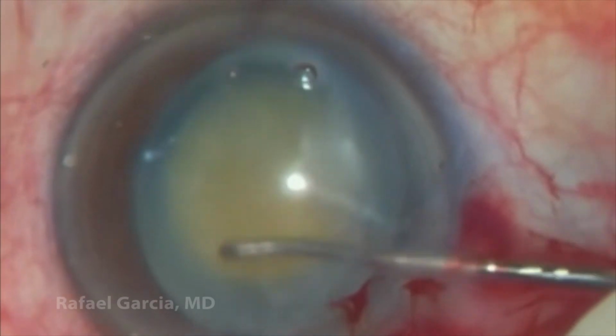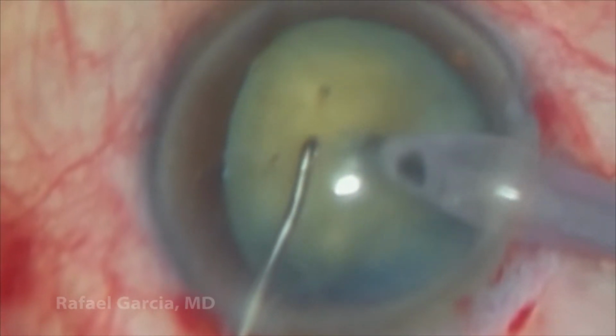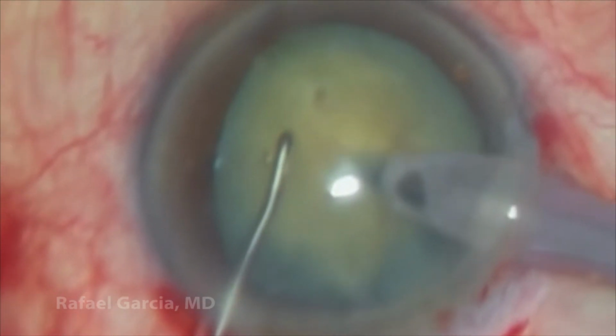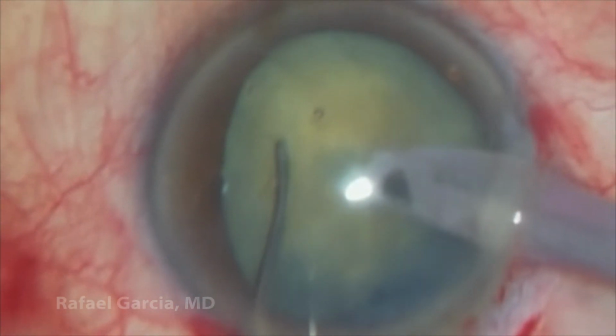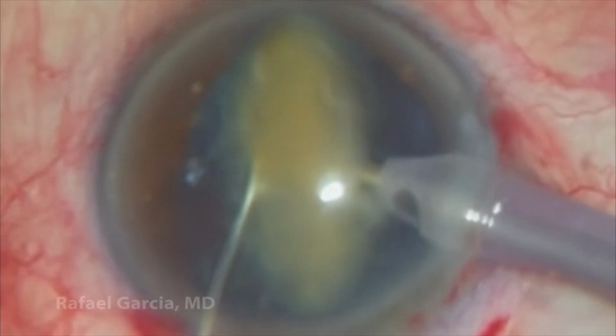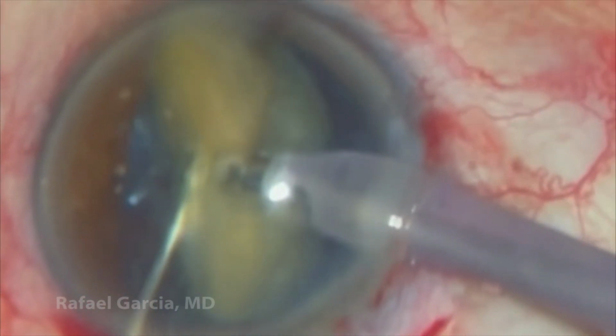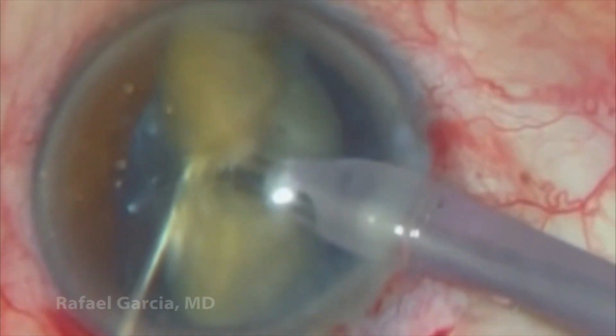In such cases, not a whole lot of hydrodissection is needed, and this is certainly one of those free-floating nuclei. So here we go, buzzing with the phaco probe, with high vacuum, chopper goes around the equator, and we get a first chop.